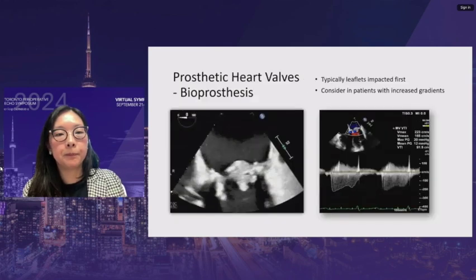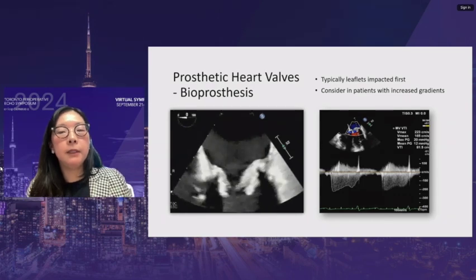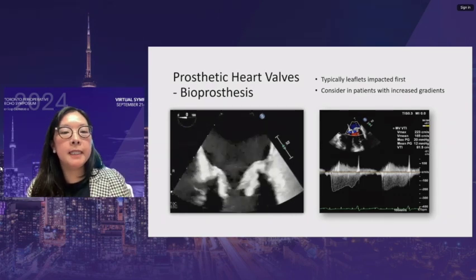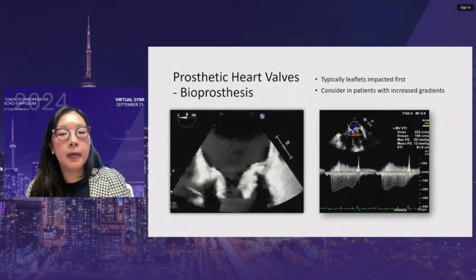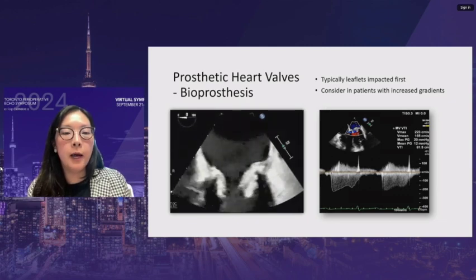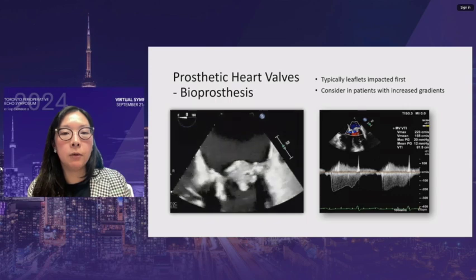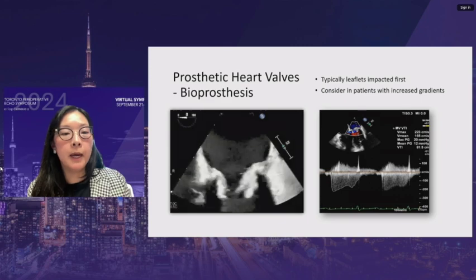For prosthetic heart valves, leaflets are typically impacted first, then the infection extends to the annulus. Patients may not have regurgitation but may develop increased gradients — besides thrombosis, infective endocarditis must be considered. A low threshold for suspicion of prosthetic valve endocarditis is necessary. Vegetation extending out to the annulus is visible on imaging.